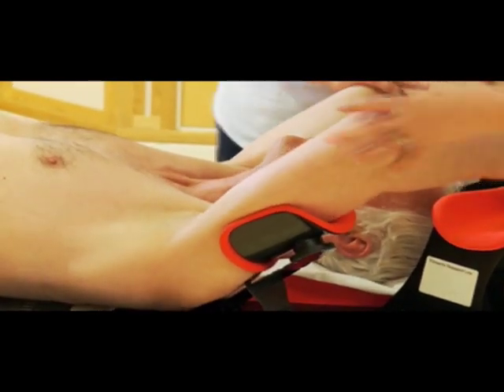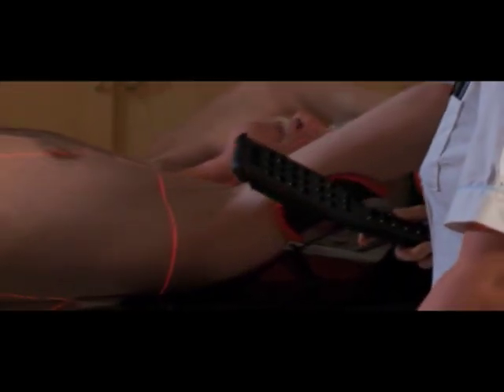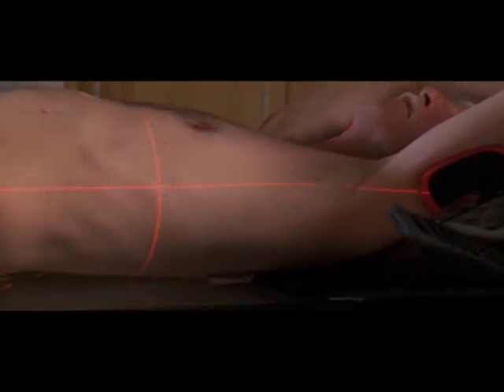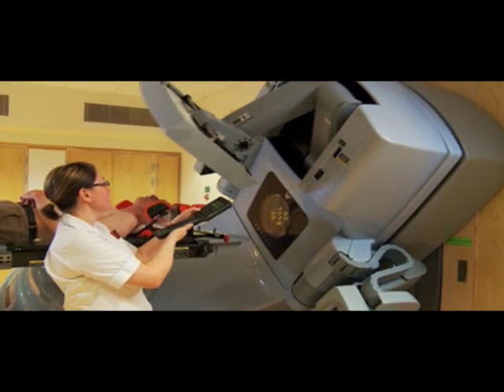In my case, semi-naked, because I was stripped to the waist. And there are all sorts of laser lights going as you're being lined up, the machine's being lined up, because again they're very careful that they only want to zap the tumour itself. You get the sense that you should feel something happening, but in fact you don't feel anything. The treatment was nothing, I thought. It was only like an X-ray, and it only lasted a short time. If your appointment was for 10 to 10, you'd be out by 10 o'clock because they had slots. Brilliant, absolutely brilliant. The machine itself would actually make a noise when it stopped, and I used to call out, "I'm done, I'm cooked."